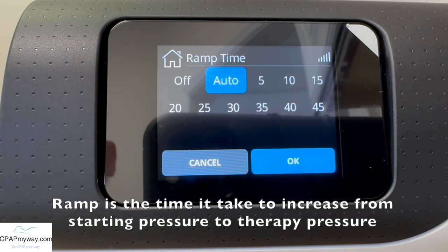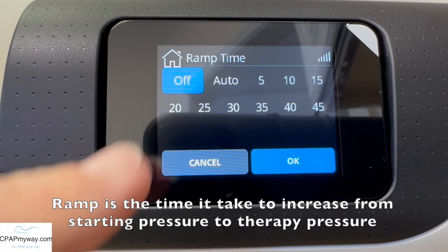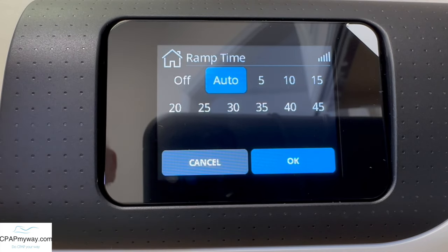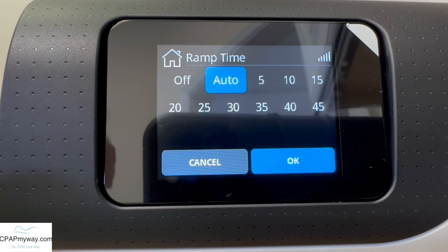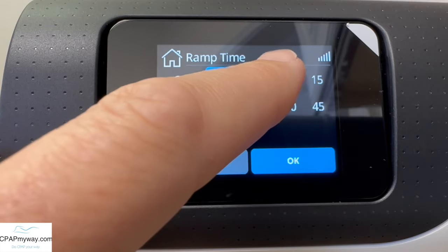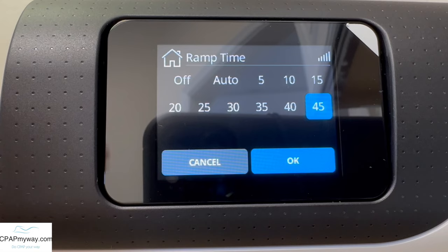The first thing you're gonna see is ramp time. Touch ramp time and you will see your setting options. You can go as low as off, or auto, which will allow the machine to monitor your breath rate and increase pressure to the therapy pressure as you fall into that sleep pattern of breathing. We really like that auto feature. A lot of people do really well on that.